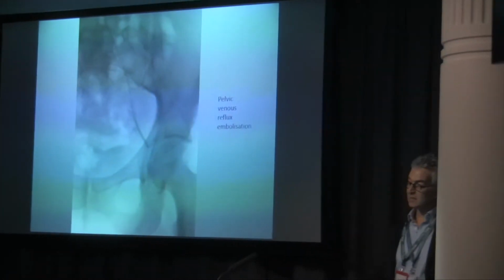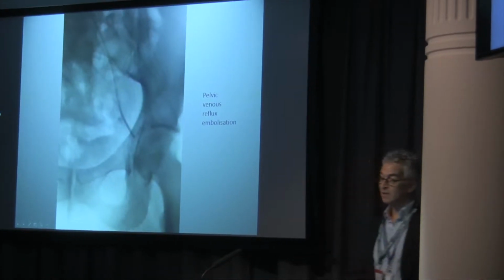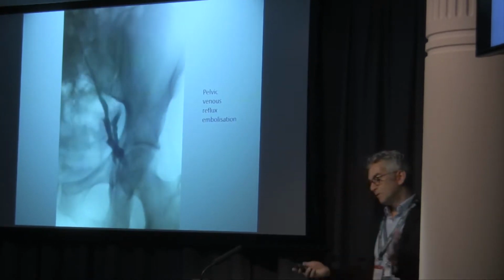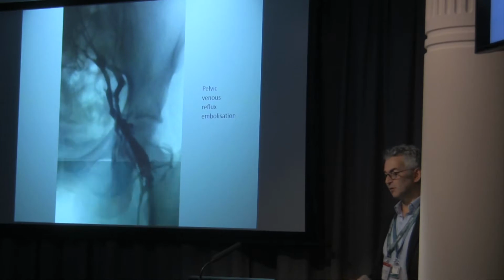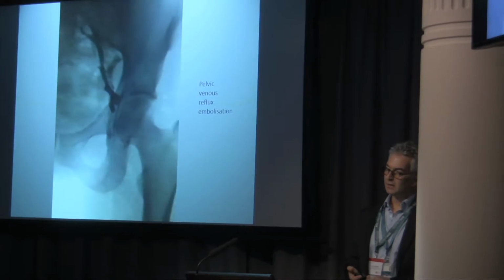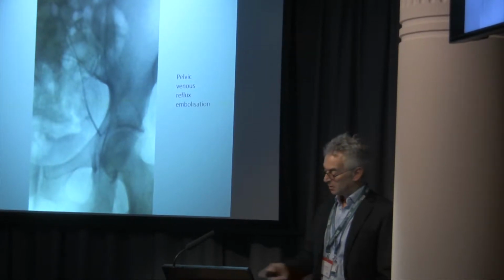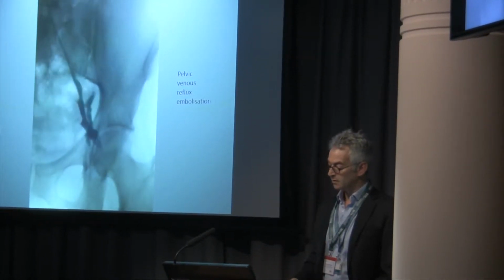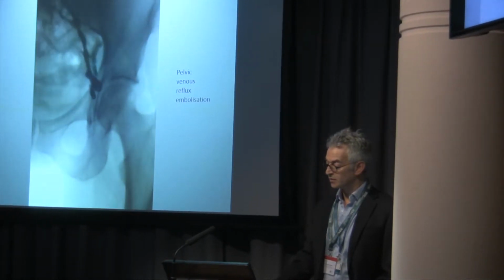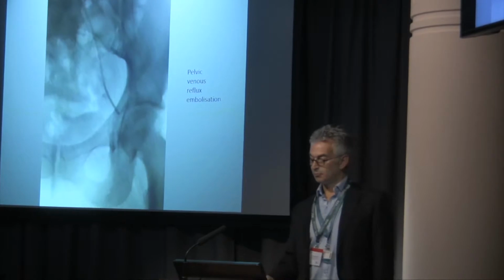Okay. This one please, I have no idea which direction this is going to go. Oh, here it comes. This is putting stuff in, so we've taken a piece of metal out with the other one, and this is putting coils in. This is something you may not be familiar with, pelvic varicose veins, pelvic congestion. You see the Valsalva, put the coils in, and that is a source of distress to mostly post-pregnant women. You put a coil in, again under fluoro guidance. That's the Valsalva, put in the coil, and now when she Valsalvas, no reflux, no varicose veins in the legs, no hemorrhoids, no premenstrual tension.